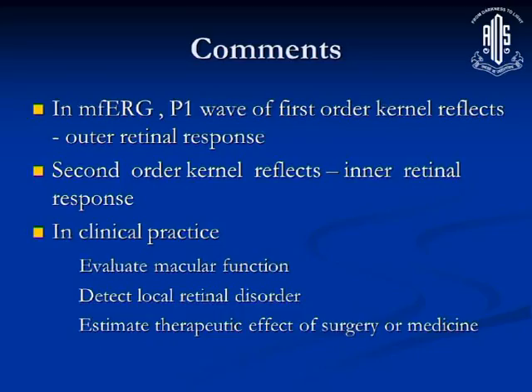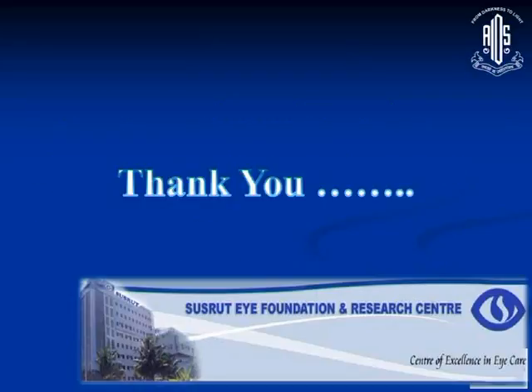So in conclusion, the MFERG P1 wave of the first order kernel reflects the outer retinal response. The second order reflects the inner retinal response, and in clinical practice, it evaluates the macular function, detects the local retinal disorder, and estimates the therapeutic effect of surgery or any medication.